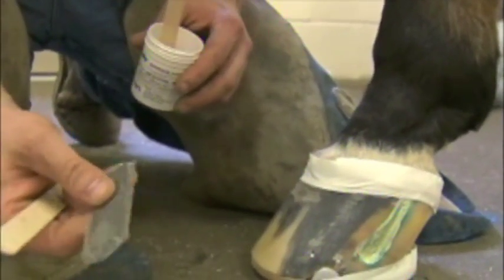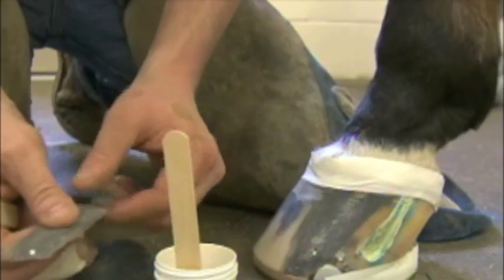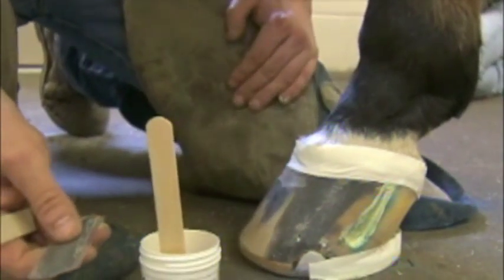We're going to use black Equilox in this horse's case. It has a little black pigment just to match the color of his foot — it just looks a little bit better.